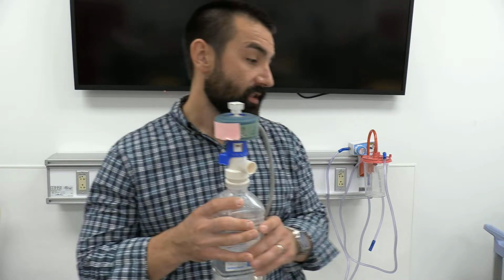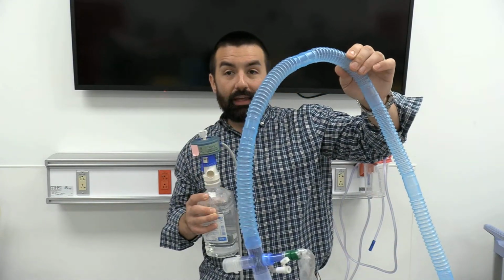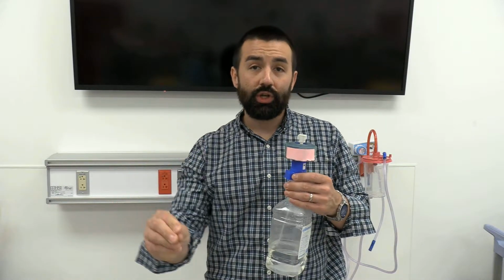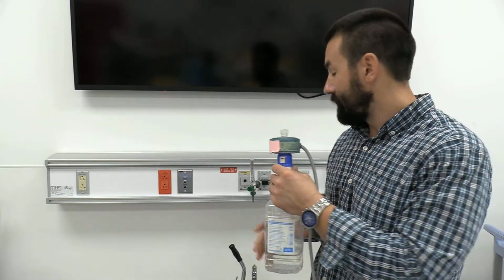But because of this corrugated tubing that we're using, gas cools off, and as it cools off, you're going to get condensation, and as we get condensation in this system, back pressure can compromise the way an air entrainment device works. Likewise, it's very difficult to truly ensure that we're delivering 37 degrees Celsius gas to a patient, especially with something like this where we can't adjust the temperature. So these are not as effective as some of your other options that I'll get into.